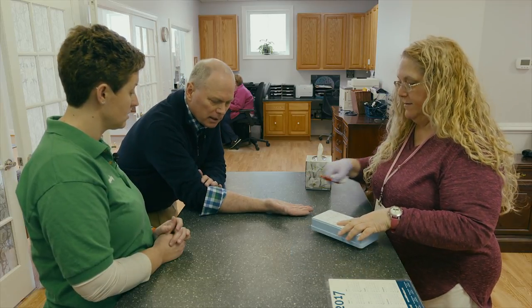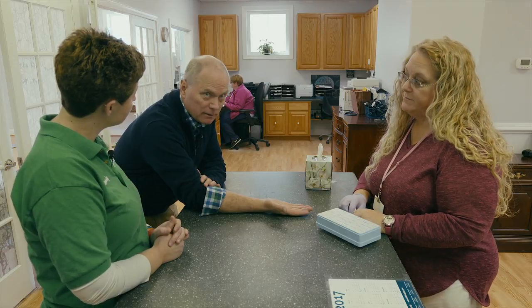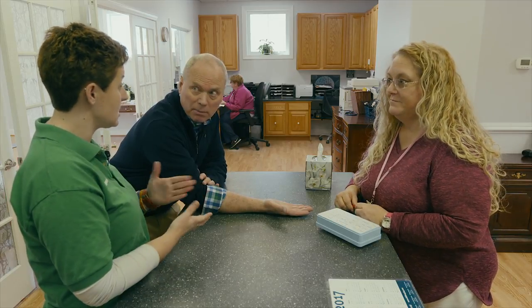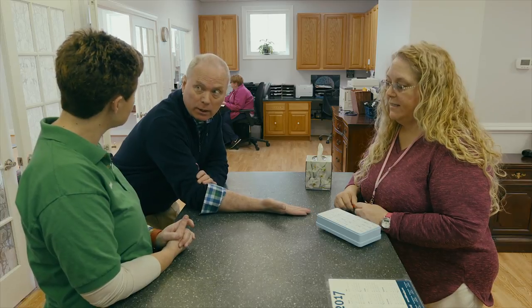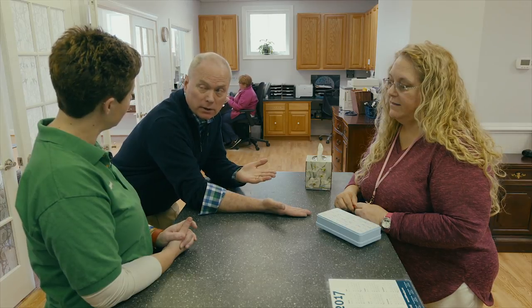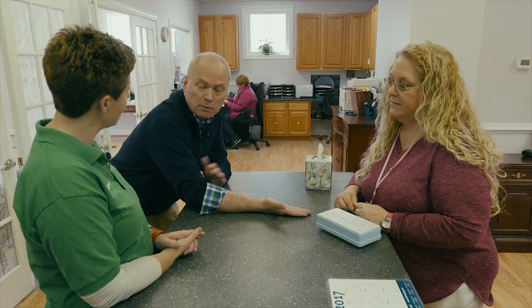And basically it's just waiting to see if you have any kind of reaction. Now, I already can feel a little itching on the grass, but give us a few minutes here and we'll see what kind of reaction it is. And the test tests for many things. So we have the ability to test for, as I was saying, outdoor things like grass, pollen, weed, trees, various molds that are outdoors, and indoor things like cats and dogs. A variety of animals, and the dust mites, which many people have and they don't realize that dust mites are part of an indoor environment. How about food?